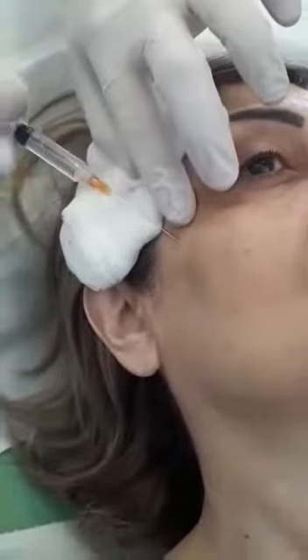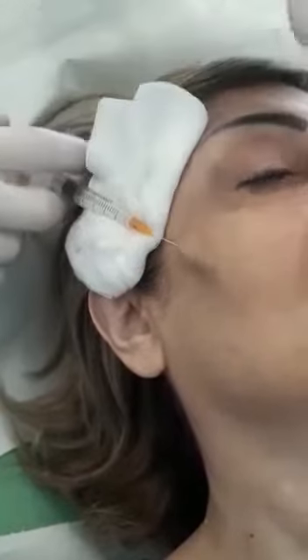Okay. Now, like with filler, madam, okay? See? She's not experiencing any pain. Now it will burn a bit.